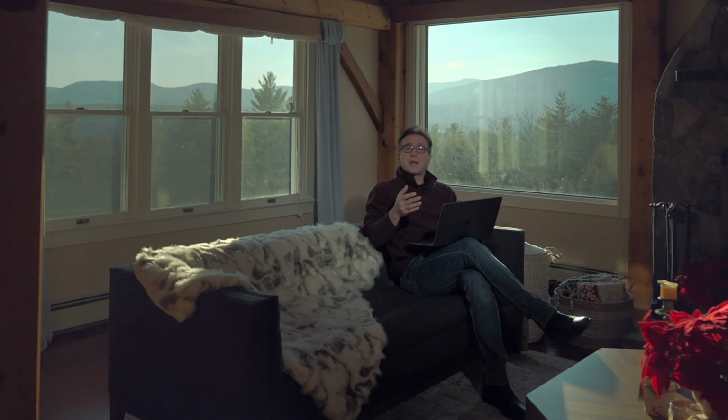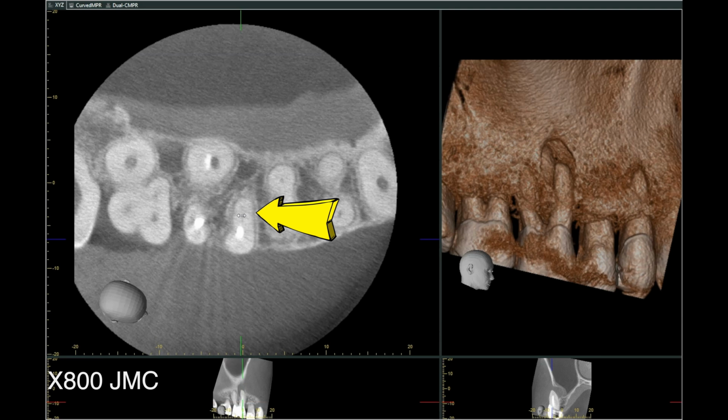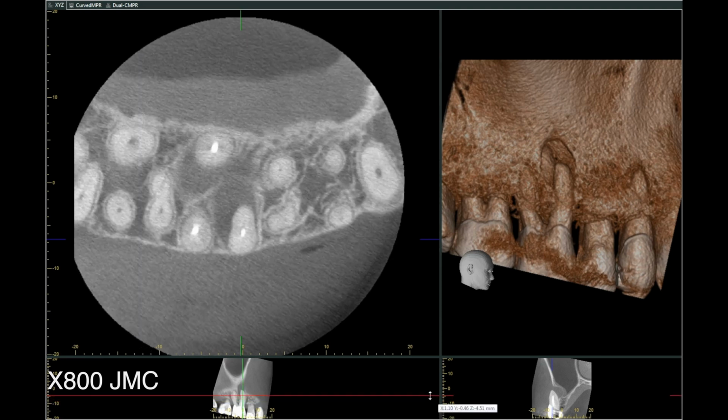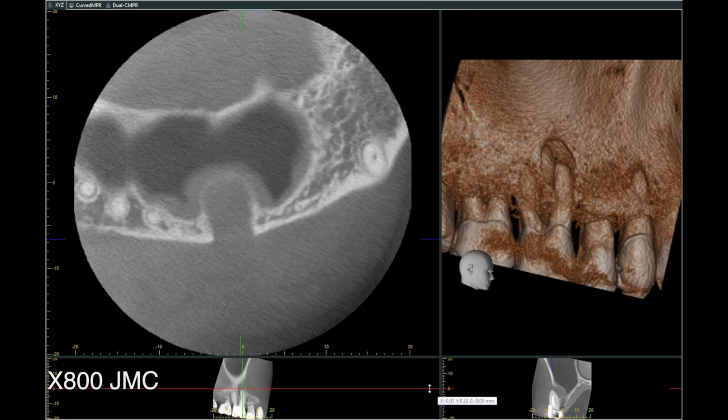Now you may say, well, why not just address this tooth surgically? And here, because the CT shows that we've had a missed MB2, I always prefer to treat these cases non-surgically first, because what the apicoectomy would be tantamount to in these types of cases would be to just kind of put a lid in a garbage can, by putting a little plug, as I explain to the patients, putting a cork at the end of the root to keep the bacteria inside the tooth.